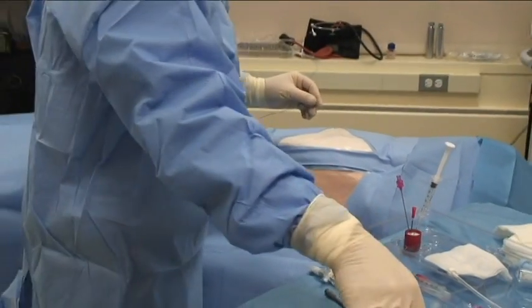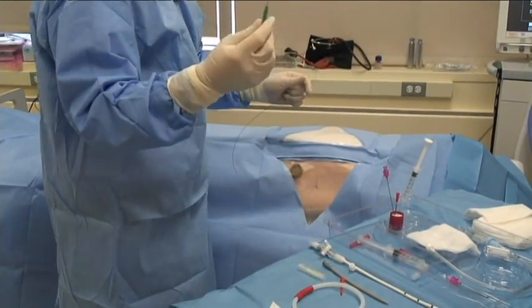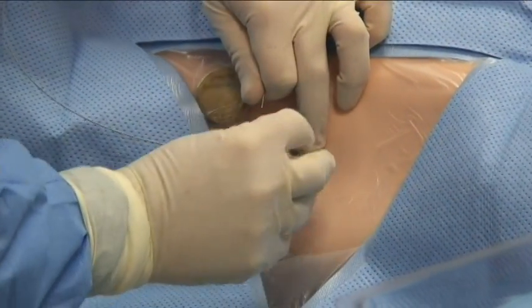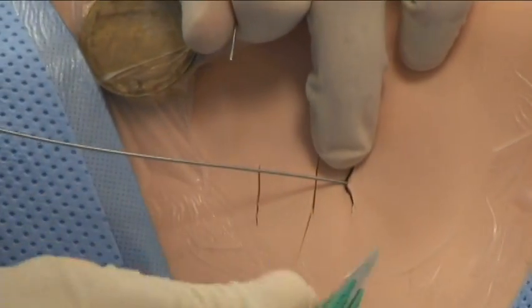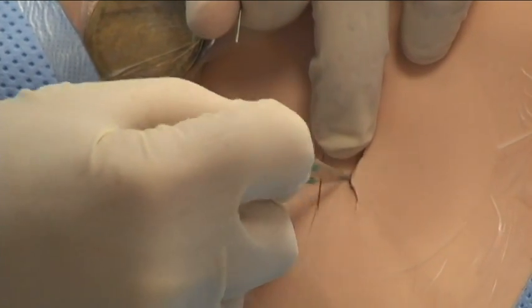At this point, I like to make a small incision. So I take my scalpel very carefully. I'm going to make a cut right over here. Careful not to cut the wire. So I'm pointing the blade away from the wire, and I'm making an appropriate incision. Does not need to be a big incision. I'm making it just big enough so I can get my tube in.